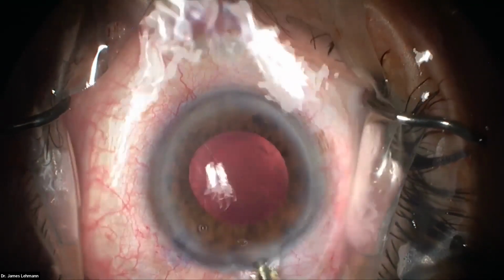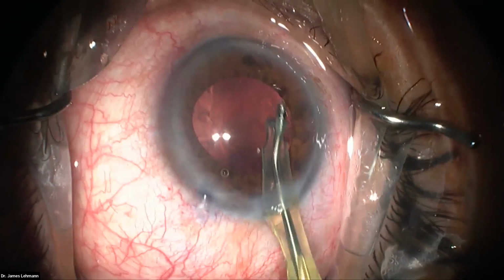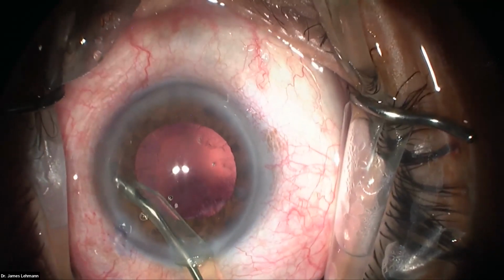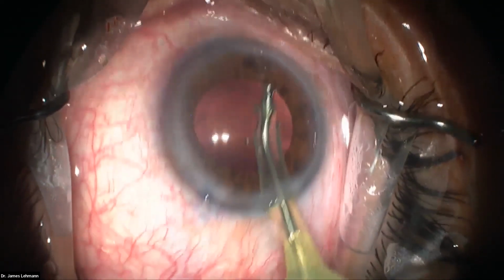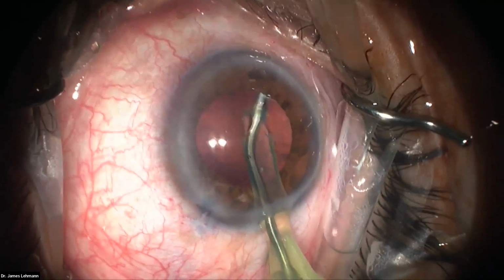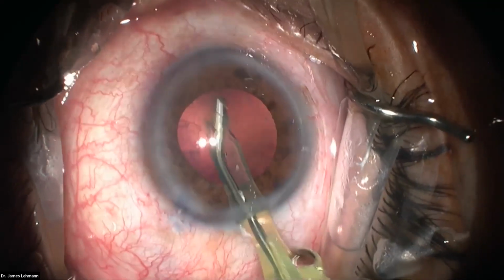Continuous irrigation on. Now this is the I/A handpiece. I'm going to go around and remove some of the dispersive viscoelastic, especially in this area of arcus where little pieces, you see that little piece was hiding right there? You've got to go in that area to make sure you get all the little fragments that cause post-op inflammation. And then just the stuff that wants to come out like this, that's easy peasy, go get that stuff. You don't have to go vacuum in the capsule.